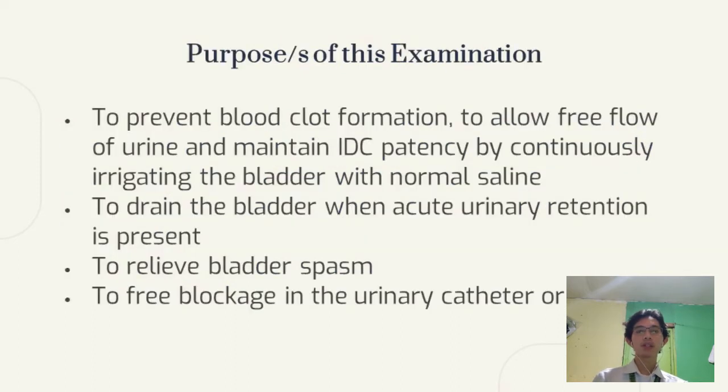For the purpose of this procedure, it is to prevent clot formation, to allow free flow of urine and maintain IDC patency by continuously irrigating the bladder with normal saline. To drain the bladder when acute urinary retention is present. To relieve bladder spasm and to free blockage in the urinary catheter or tubing.